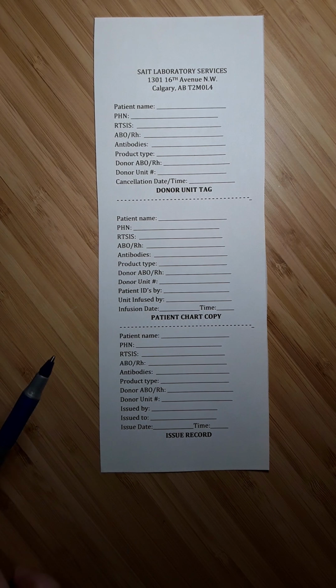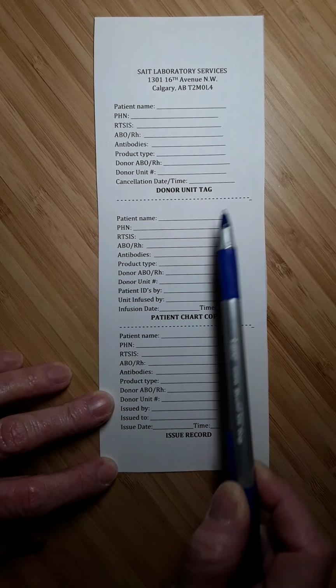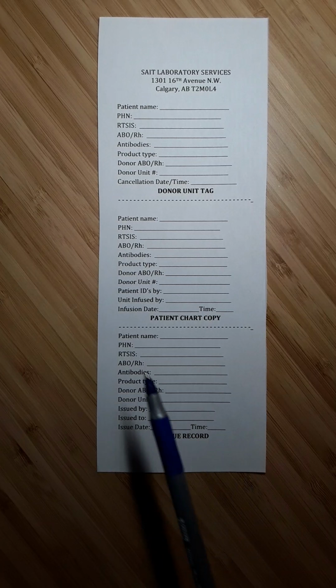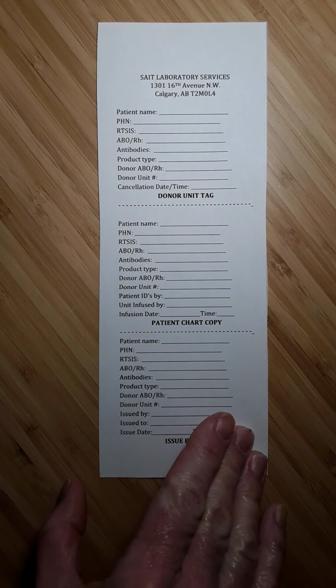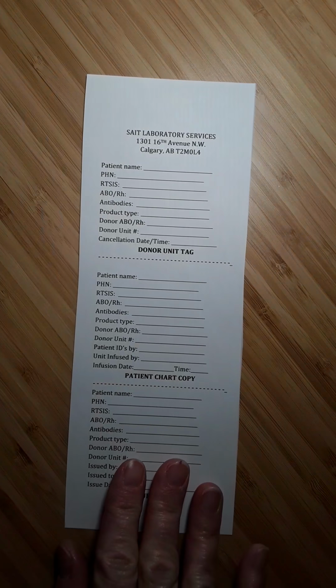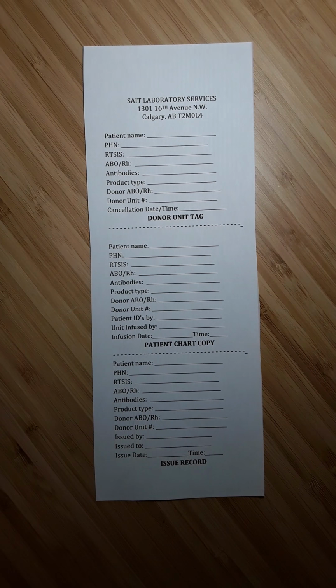This is a 3-part tag, as it notes on the handout that I've given you. So you might be able to see these dotted lines, and on the tag, it's typically perforation so that it's easy to tear the tag at those parts of the tag. The back of the tag will have a coating on it, but it can be easily peeled off, and then the tag itself will be sticky, so it can get applied to the unit of blood or the blood product, as the case may be. So let's go through the tag.